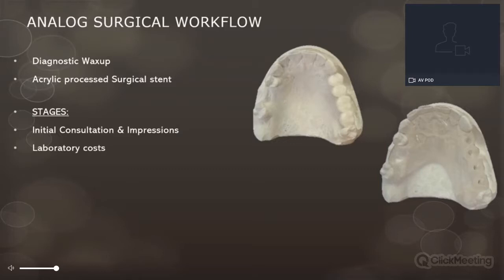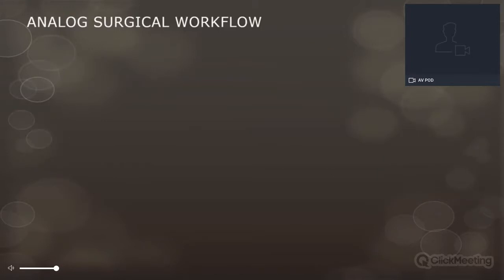Once we've taken the impressions, these need to go off to the laboratory, and there's an associated laboratory cost. We then need a second appointment to consent our patient and to demonstrate what the treatment plan proposed would be for our specific treatment case.